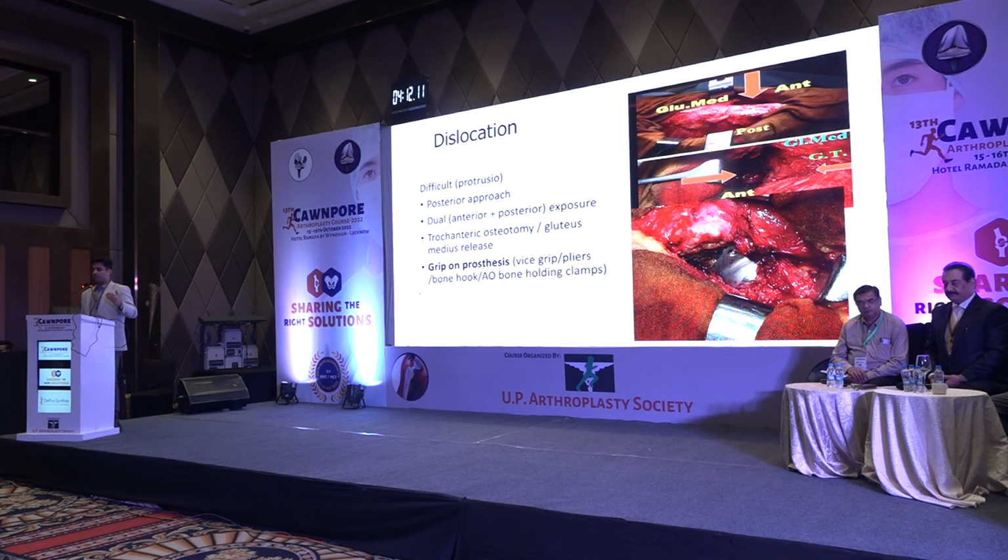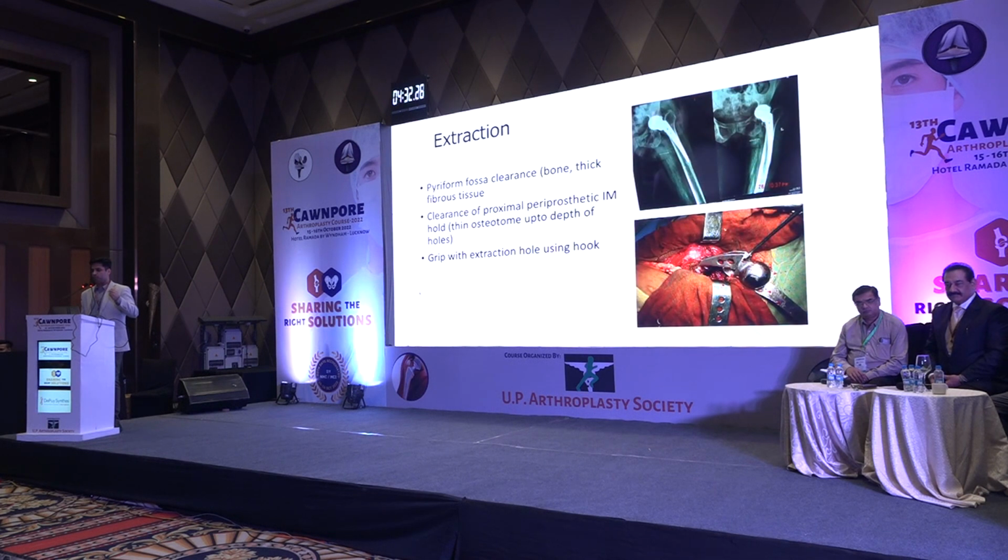As far as dislocation is concerned, I said you can sometimes manage with just the posterior approach, and this is one place where I use the posterior approach. I was trained in the posterior approach. I started doing a lot of hips with the anterolateral approach, then I had to do them again for revision of my bipolars. Sometimes dual approaches, and like I said, you need instruments to pull out the implant sometimes. So extraction cannot be easy all the time.